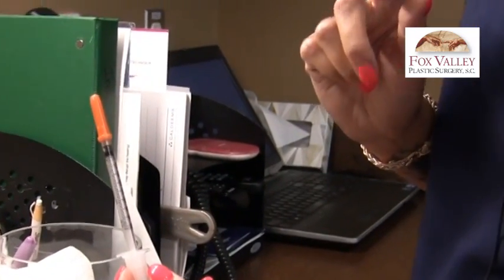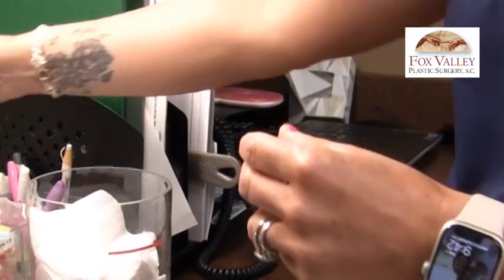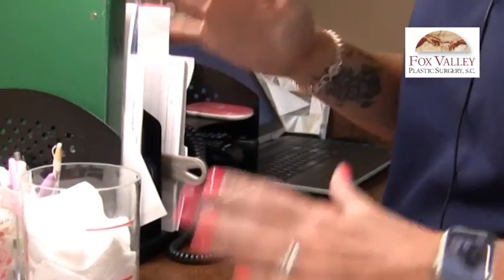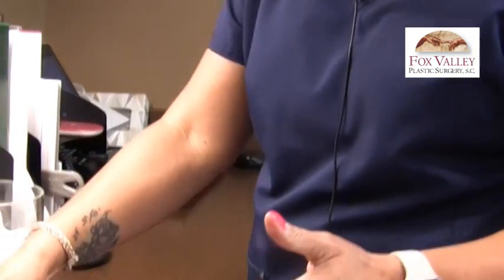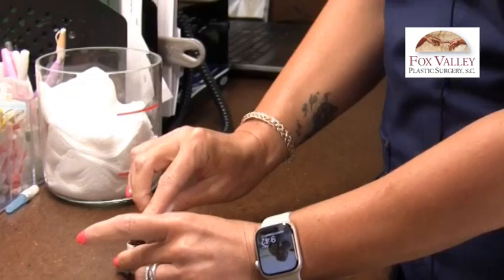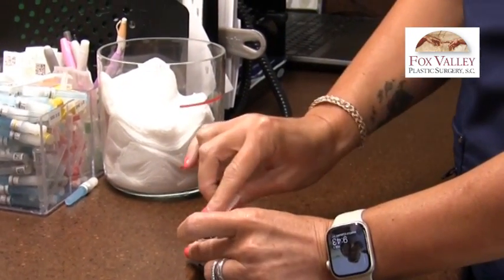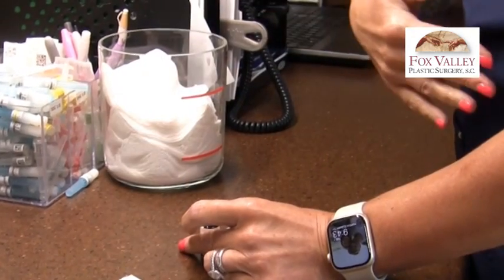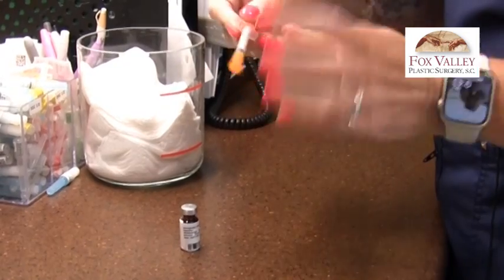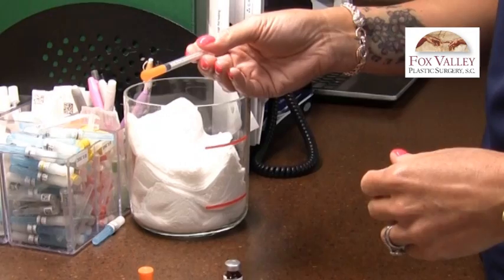It's important to note the differences in the insulin syringes and the dosing. When we're ready to dose, make sure your hands are nice and clean. Take your alcohol swab and swab off the top of the vial of medication. Save the alcohol swab — you're going to use it to wipe your belly to get ready to inject. Then remove the stopper from the top of the insulin syringe.